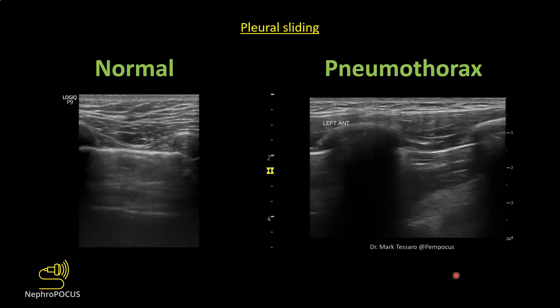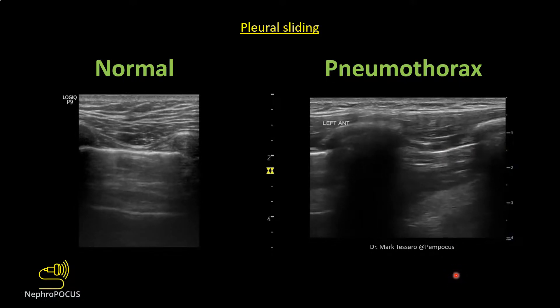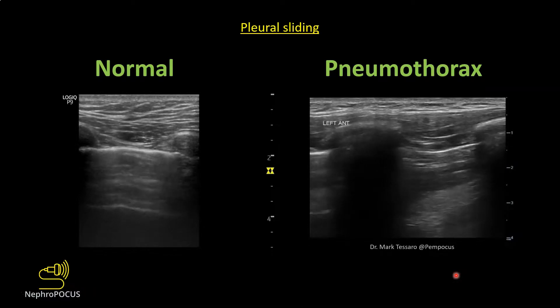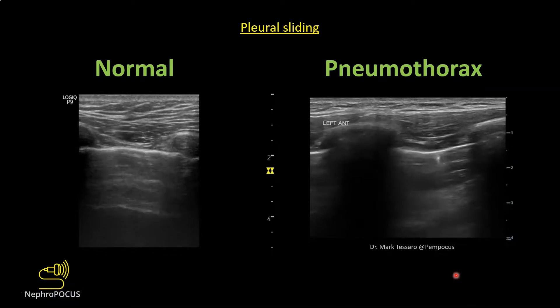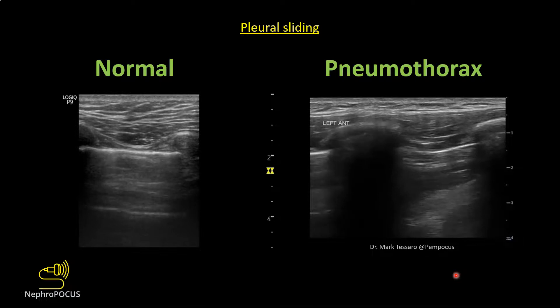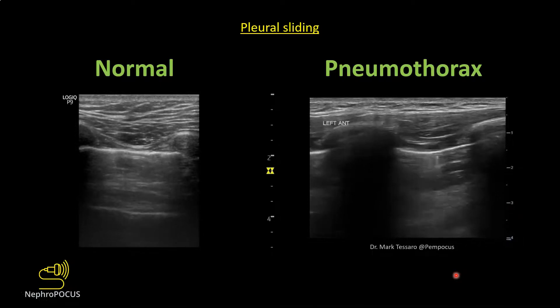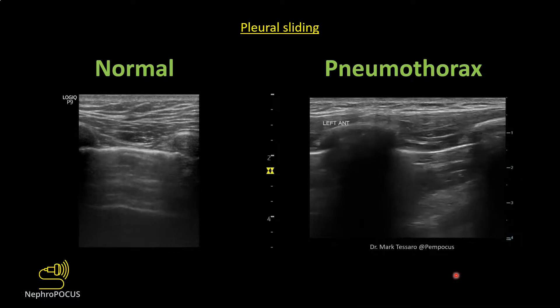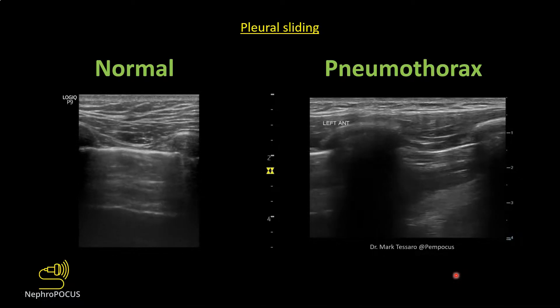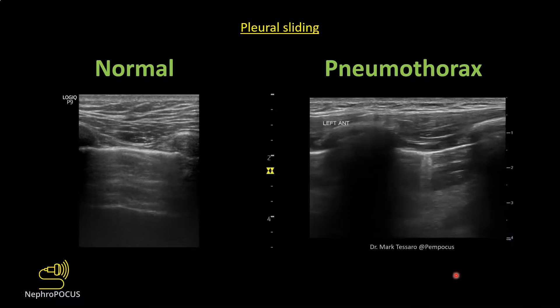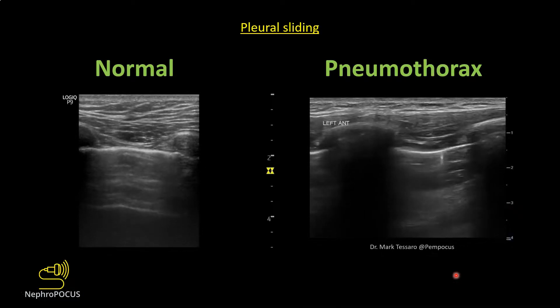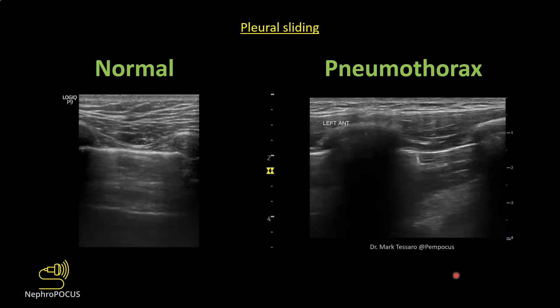Lung point assessment is particularly important after placing a central line — you don't always need a chest X-ray to rule out pneumothorax. Air rises in the chest, so pneumothorax is expected in the upper anterior zones. If you carefully sonoauscultate the upper anterior zones and find no lung point or non-sliding pleura, there is no pneumothorax.